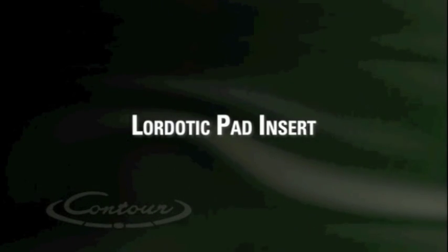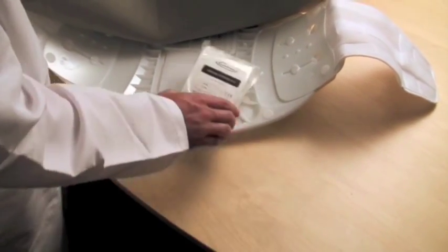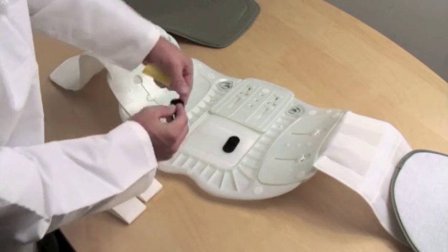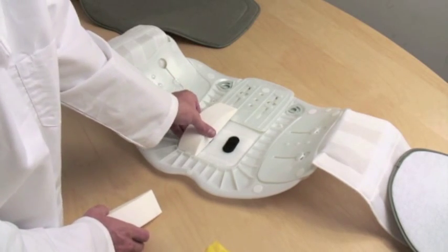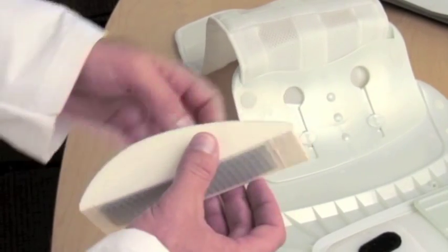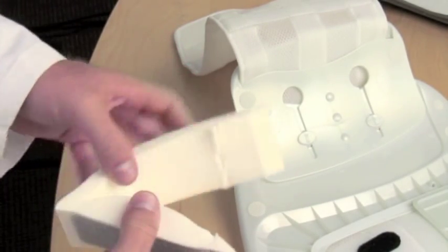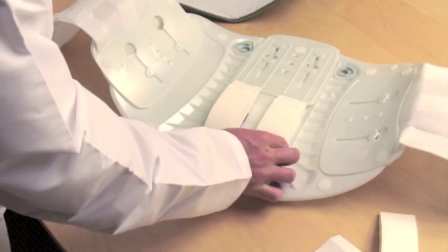The lordotic pad insert. Different patients' anatomies tend to have more or less lordotic curve in the lumbar spine. Aspen offers lordotic pad inserts to accommodate for large curves. The pads come in a set of two, and both pads are designed to be used on one brace. The overall shape of the pad is teardropped, and the thicker portion is intended to fit the lower part of the patient's spine. The pad has a longitudinal cut, allowing the practitioner to adjust the overall thickness by tearing along this line.